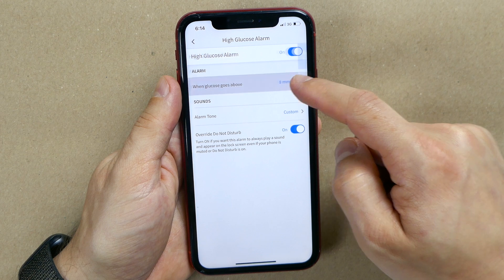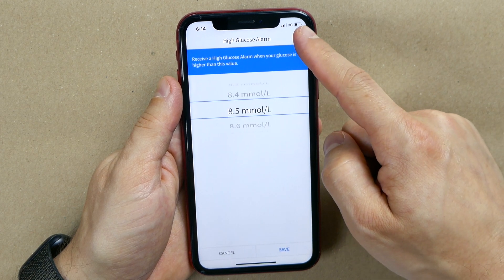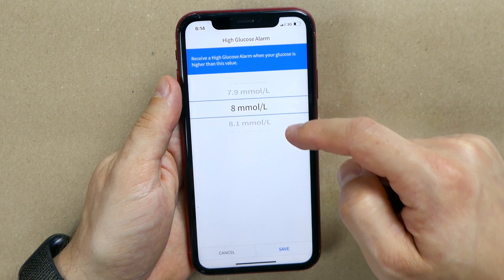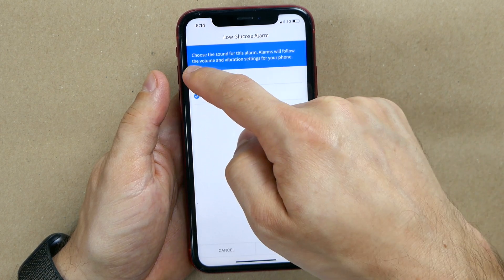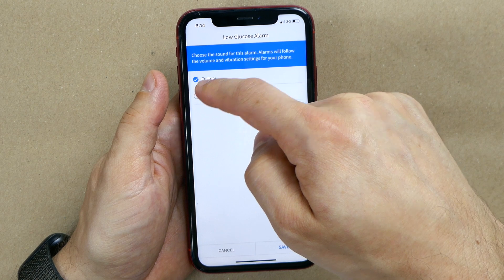If you have Freestyle Libre 2, your next feature is alarms, and this is such a powerful feature for blood glucose management. Not everyone has alarms so I won't cover them in detail here, but I have a separate video on this topic linked in the show notes. There is one more thing about alarms I learned this week that I really want to share with you.